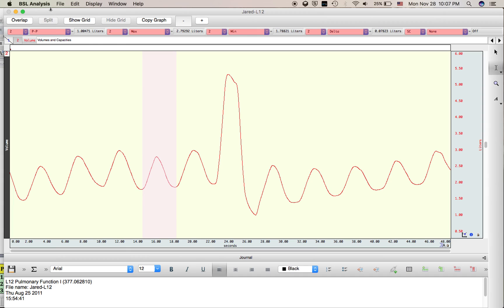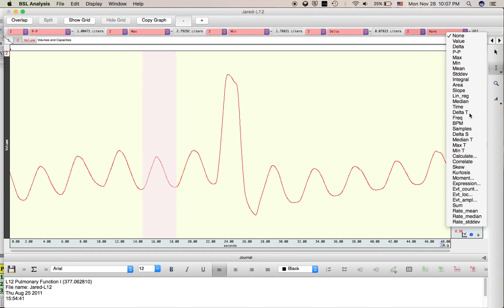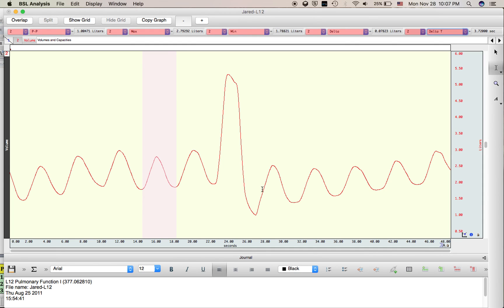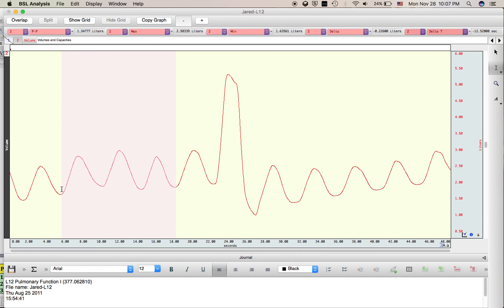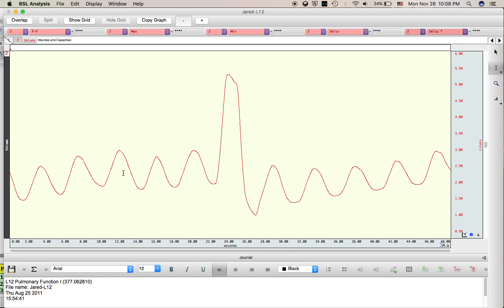I'm going to use the highlight tool and highlight one normal breath. Using the peak-to-peak tool, this is the tidal volume — roughly one liter. To find the breathing rate, I'll use the delta-T value: the delta-T is roughly 3.7 seconds for one breath, so one breath over 3.72 seconds times 60 seconds per minute gives the breathing rate. Alternatively, I could highlight two or three breaths — for example, 3 over 12.52 times 60.